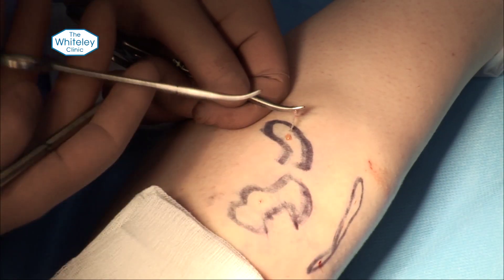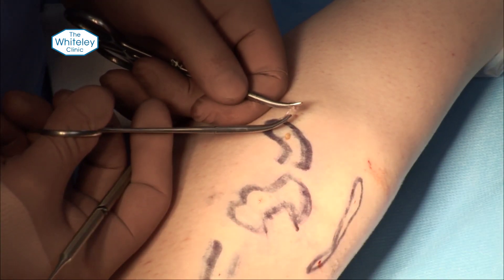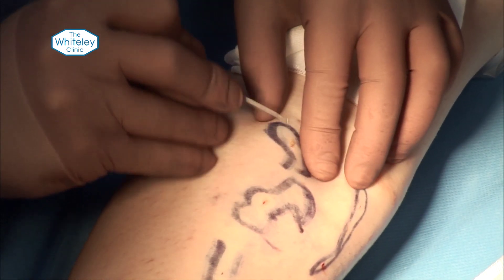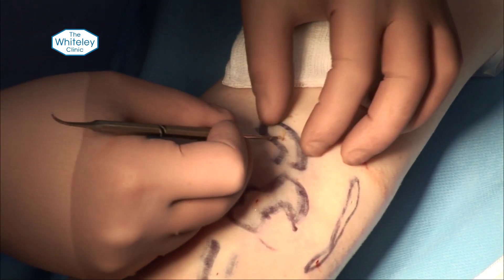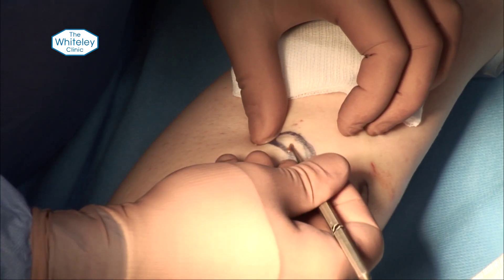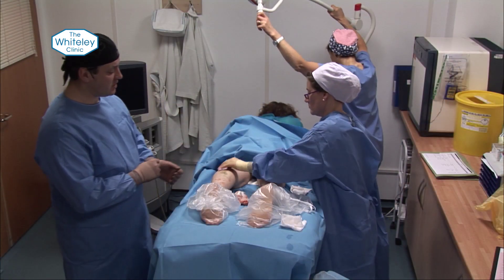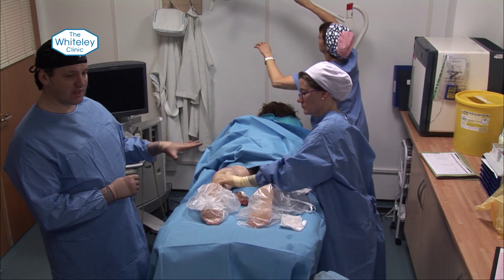We tend to use a three-clip technique. When you've got one end you obviously only need two. You put one clip to stop it disappearing and then two clips to walk along each end of the vein. The rest is just steri-strips. It's still in a head-down position so that you keep the bleeding to a minimum, then bandaged legs and putting into stockings.